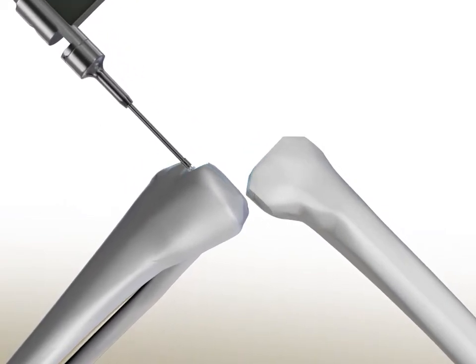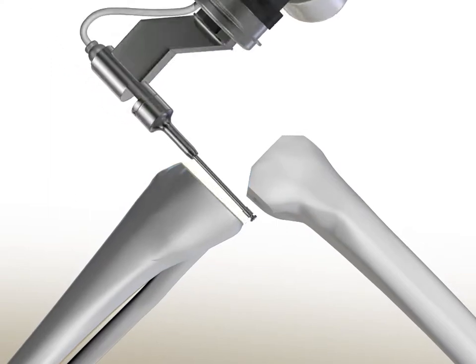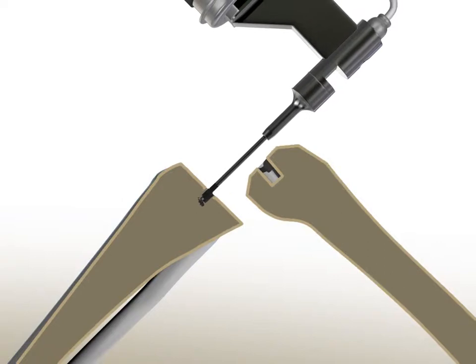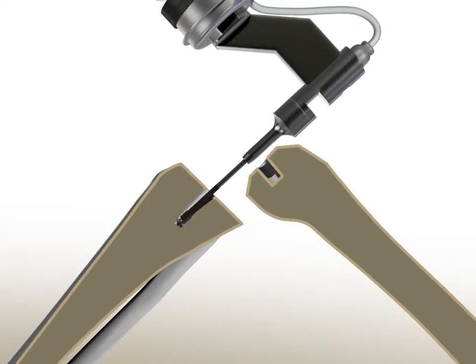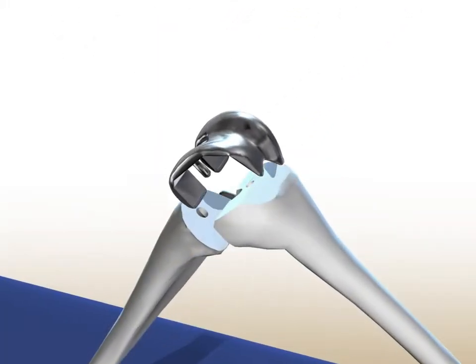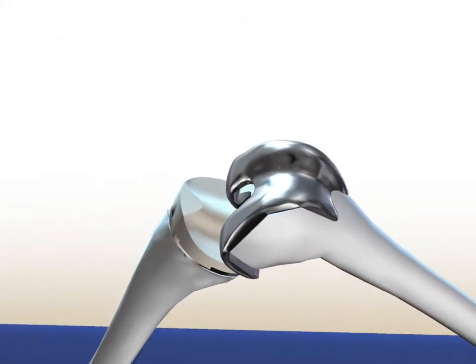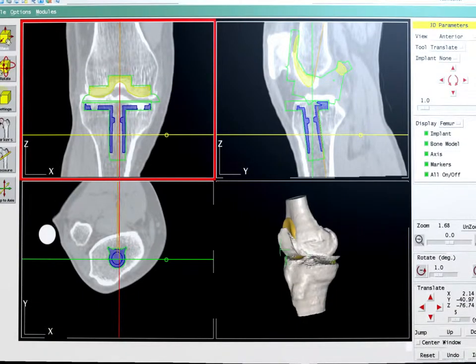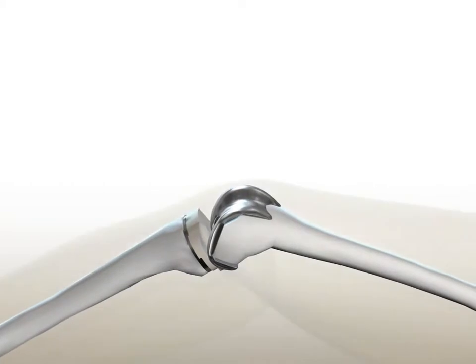This process takes about 20 minutes. The surgeon closely observes each step of the process on the OR monitor. When cutting is complete, the surgeon inserts the implant into the patient's bone and evaluates the fit. RoboDoc ensures optimal fit and fill with submillimeter dimensional accuracy.